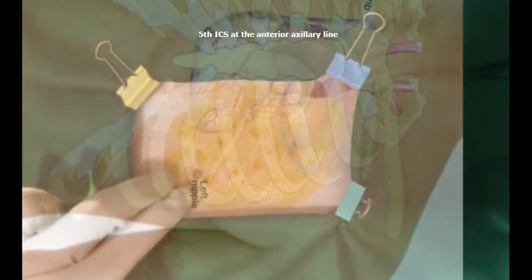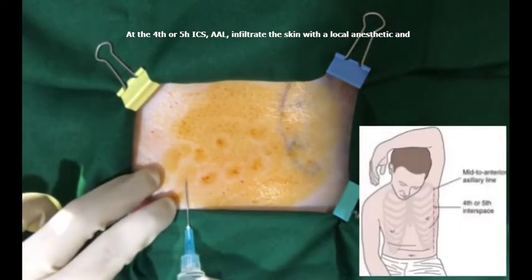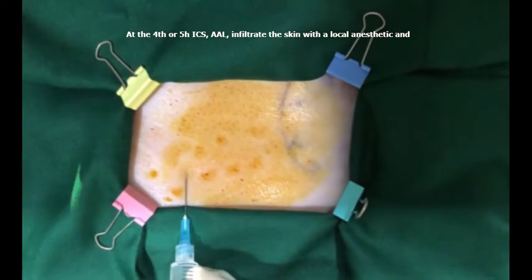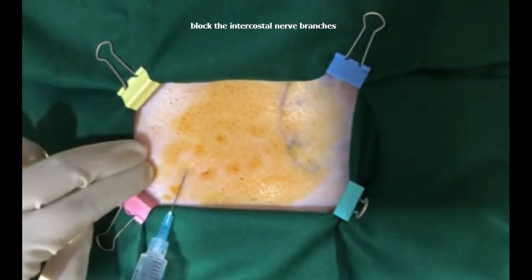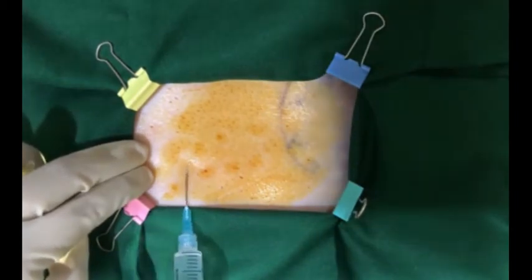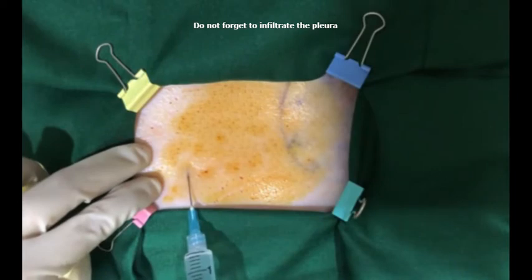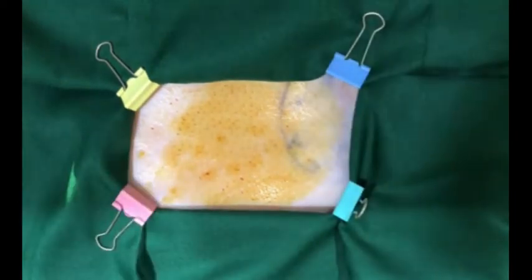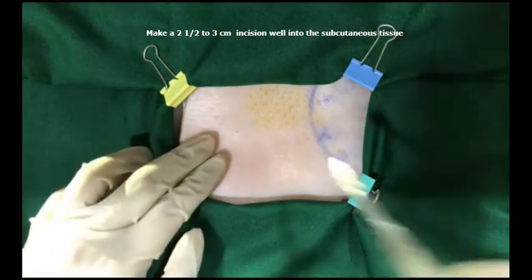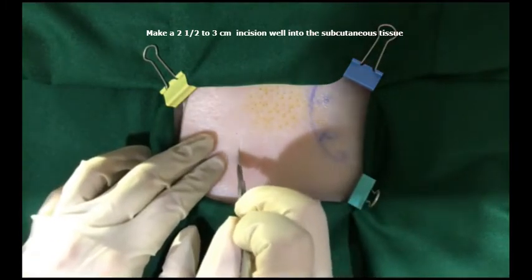At the 4th or 5th intercostal space, anterior axillary line, infiltrate the skin with a local anesthetic and block the intercostal nerve branches. Do not forget to infiltrate the pleura. Make a 2.5 to 3 cm incision well into the subcutaneous tissue.